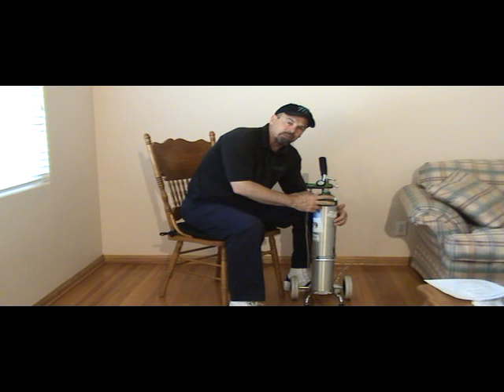Keep it away again from any open flames. You don't want it next to anything that will create excessive heat. Keep it out of the way of dogs, of children, anything of that nature. Oxygen in a tank is a little more dangerous than it is in an oxygen concentrator, so you probably need to take a little bit more care. Make sure that it is turned off, that it is not continuing to run if you're storing it somewhere.